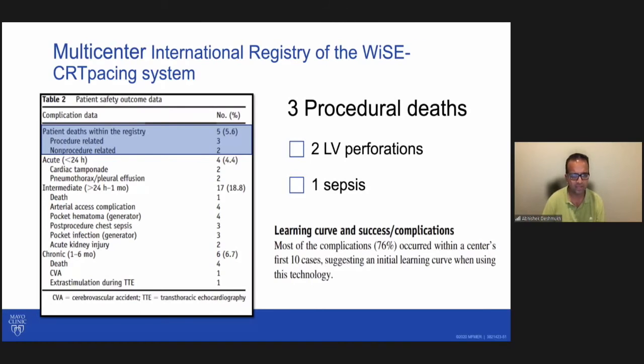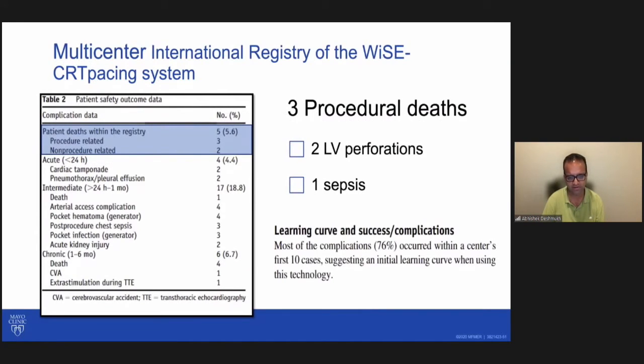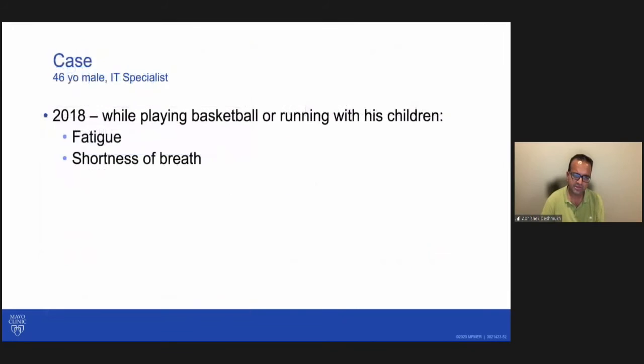So this is one option these patients have if you are unable to place an LV lead. Certain other options would be conduction system pacing, which I know was covered before, so I would potentially skip that. Another issue comes up in patients who need a device which can do the job of defibrillation and the job of pacing, but with no leads involved. So is there a way we could do that?